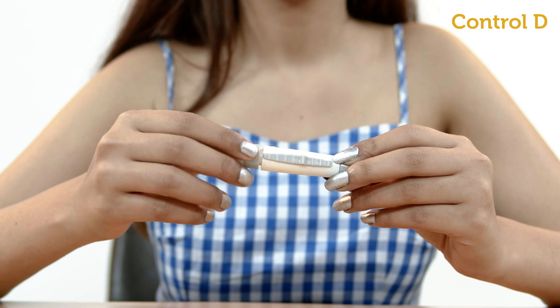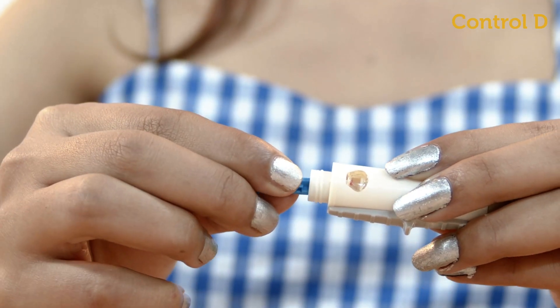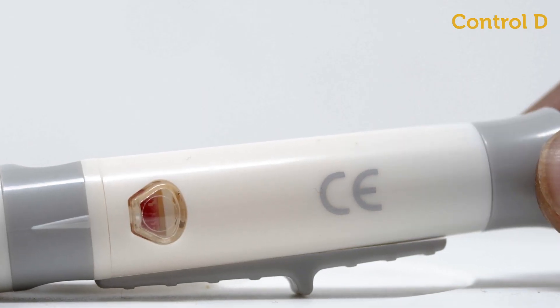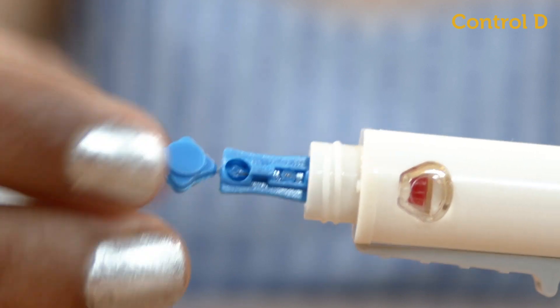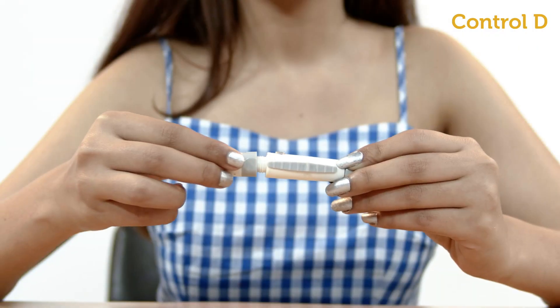Twist open the cap of the lancing device and insert a lancet. Press down firmly until you hear a click and see the indicator turn red. Twist to remove the star cap on the lancet, then close the cap of the lancing device.